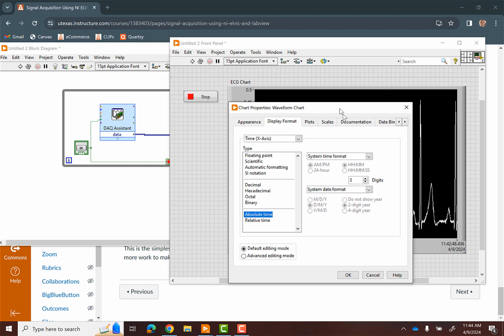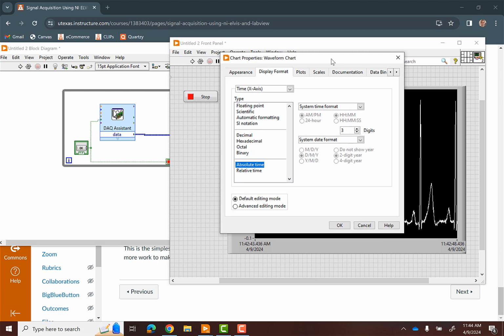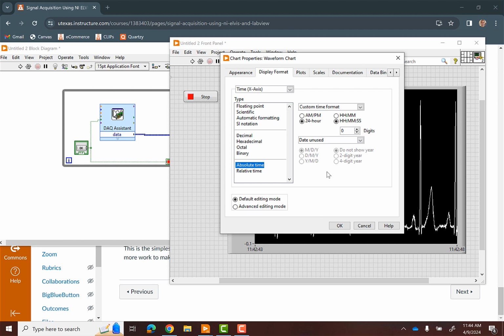We can change our display format for all our data, right? For our numbers. And so this is like date and time in the x-axis, and that looks kind of nasty, right? Not something I really want on that axis. So I can change this to be custom time format, and I can use hour, minute, seconds. I could even put some digits. I don't want the PM or AM on there either, so I'm going to take that off and put just that. And then I can do date unused to get rid of the date, which is a little useless for us too, right? So I can do that. If I want to display numbers, I could do that too, but I'm not going to worry about that.